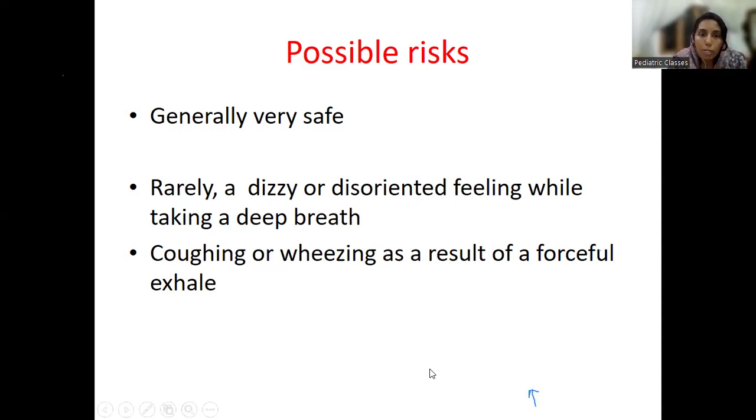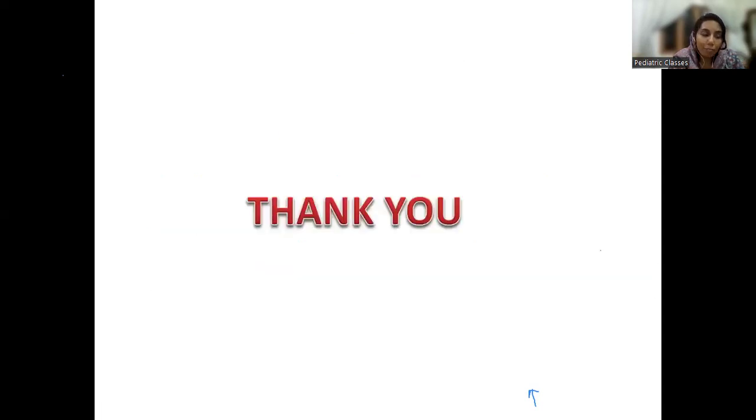Sometimes the patients may get a dizzy or disoriented feeling while taking a deep breath. And sometimes they may have coughing or wheezing as a result of a forced exhalation. These are only the possible, a little bit of risk in case of a PEFR. So that is all about our PEFR class. I hope it is clear for you. So this is the PEFR thing.